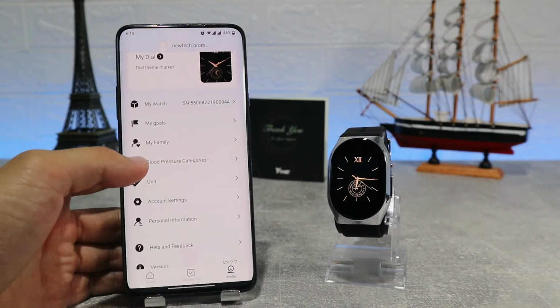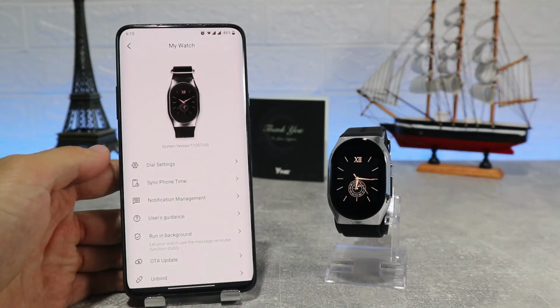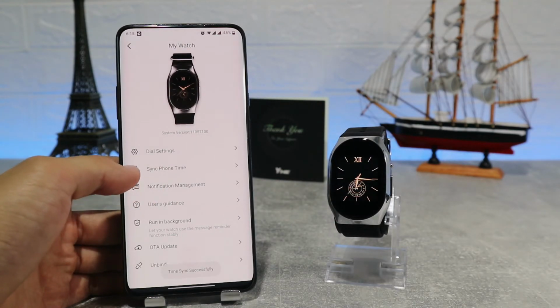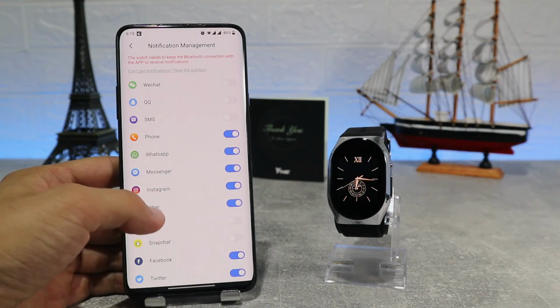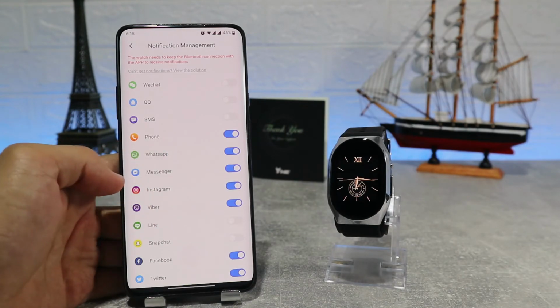Next up, we have My Watch. Here we have sync phone time. With this, we will synchronize the time of the watch with that of the phone if this has not been done automatically. Next, we have app notification settings where you can choose which apps from your phone can send you notifications, or if you want you can turn them off altogether.